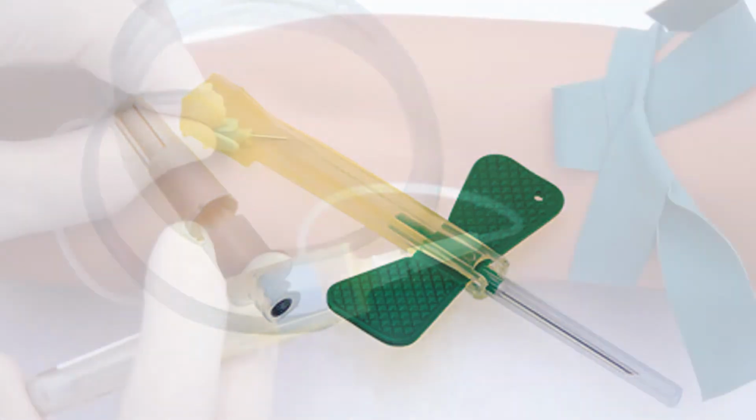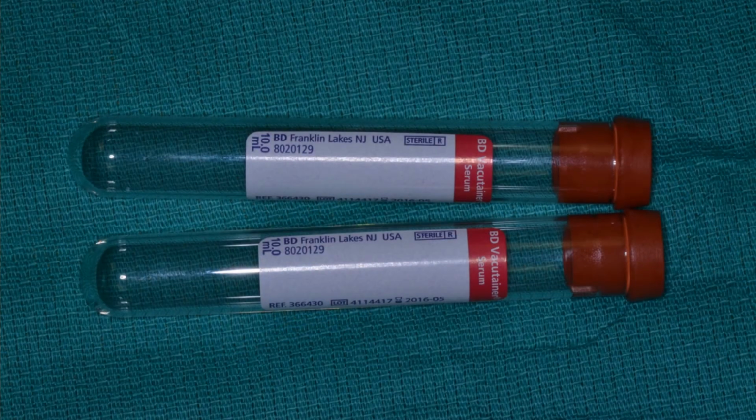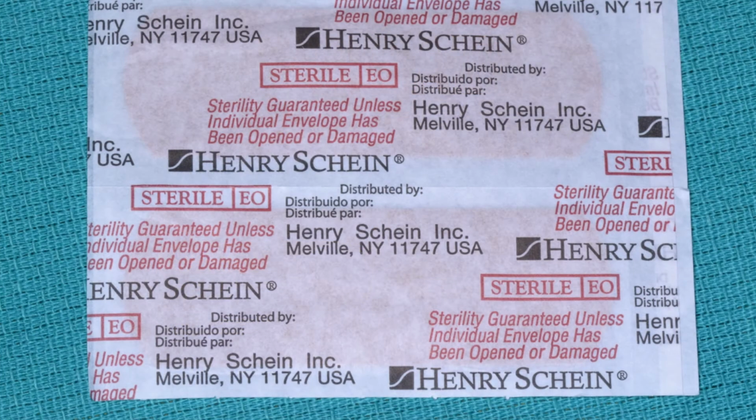And then we have the 2 red glass tube Vacutainer bottles. These are 10 milliliters. Then we have some bandages, which you can buy from Band-Aid, or if you want to support your local dental supply company, they usually sell them too. I like the fabric ones myself. This is a photograph demonstrating the blood actually collected in the 10 mL glass red tube top.